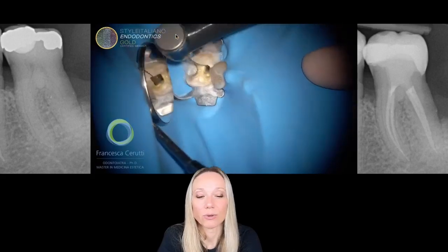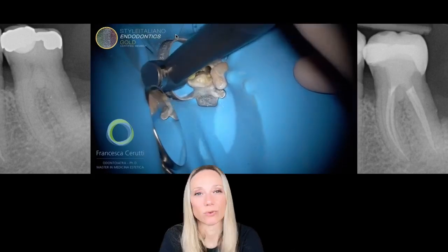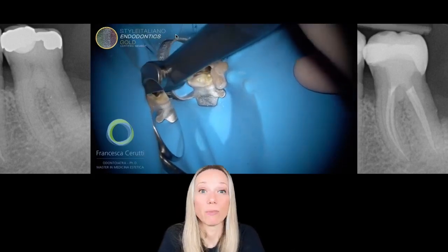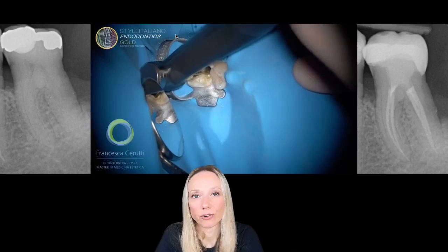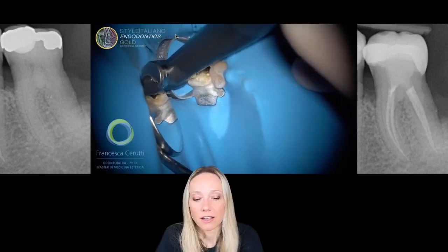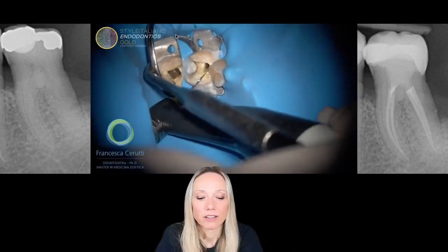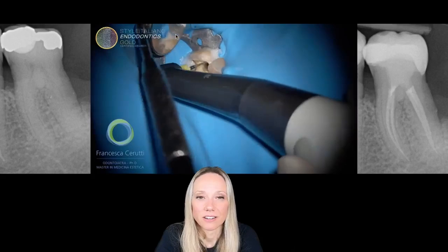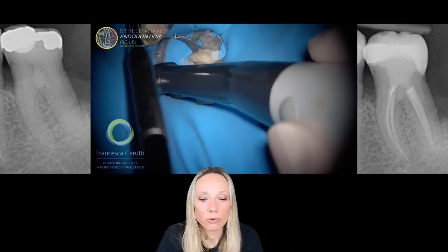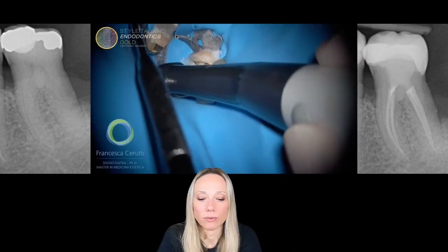And then what do I do? I clean because I don't want the debris to get stuck inside of the root canals and create blocks that I'm going to struggle to pass later. And you see that when I can go deeper with my shaping, then it's easier. And so I proceed with my 2004.